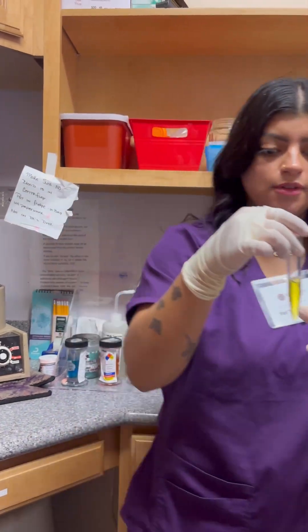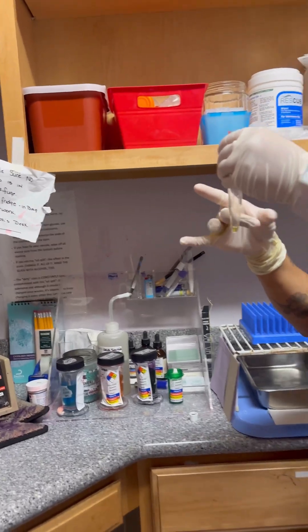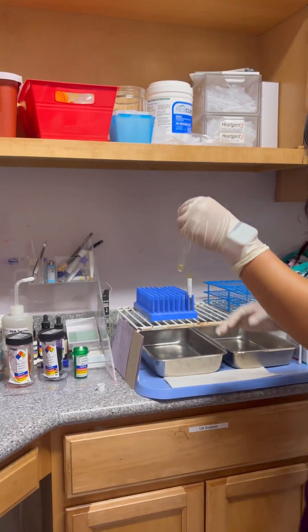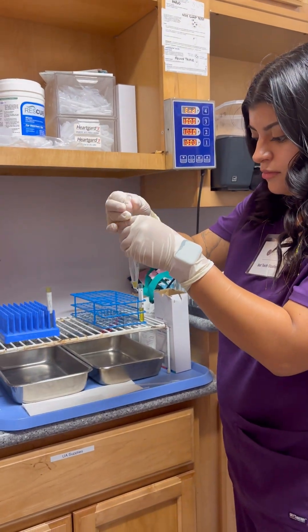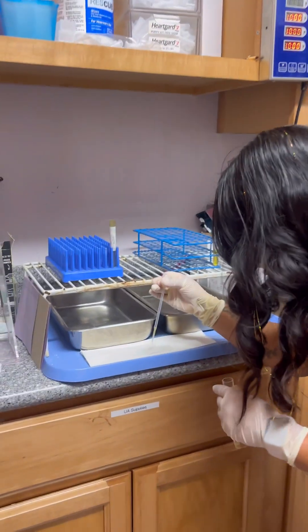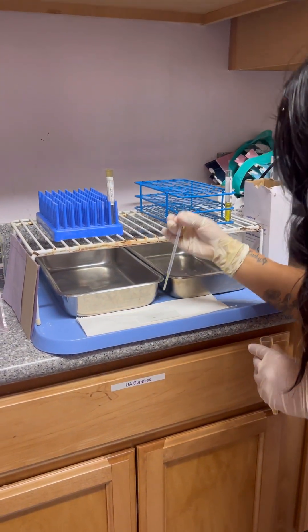With my sample, I'm going to pour off all of this. Shake off the pellet. Put a pipette.